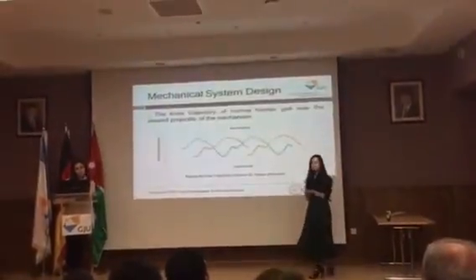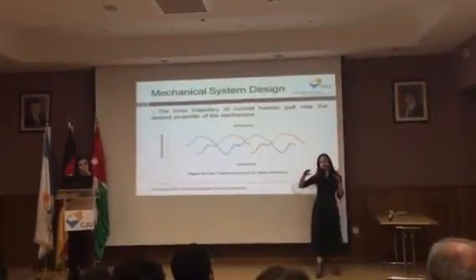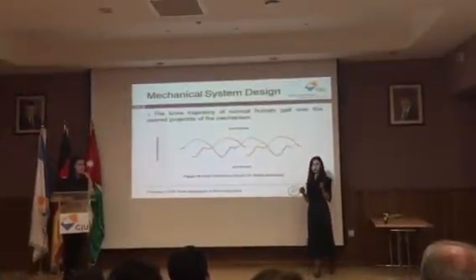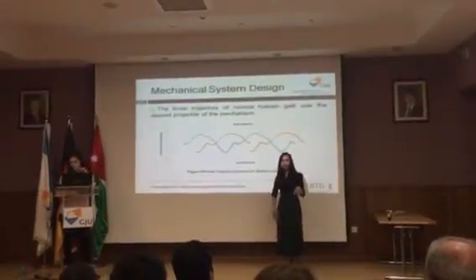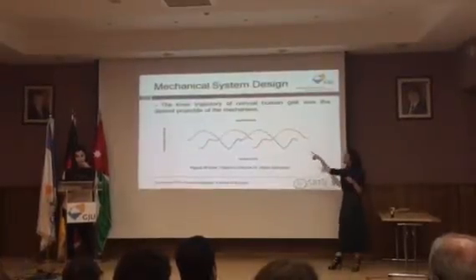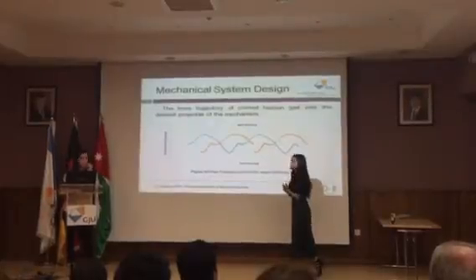Before we get into the mechanics of the system, we needed a reference, and by reference I mean we needed the movement or the trajectory of a normal human foot. To do that, we obtained the data sheet of a gait trial that our professor provided us with, and we basically plotted a graph of the cycle phase against the knee position.